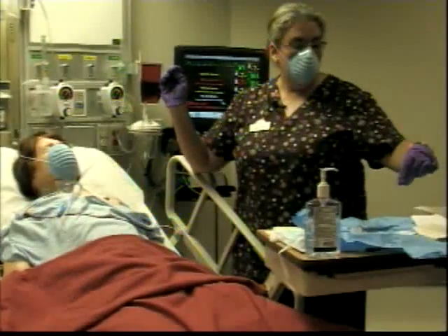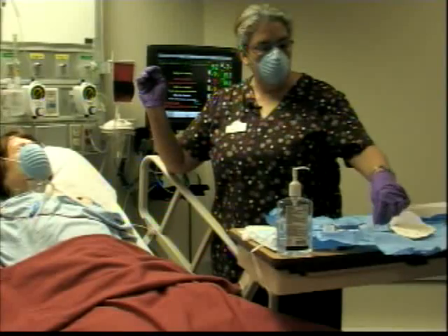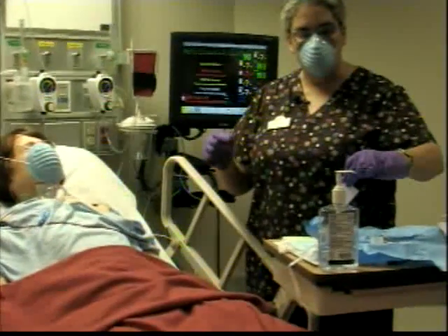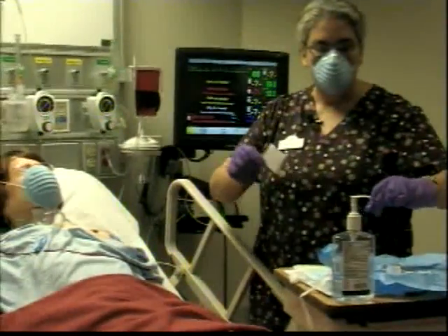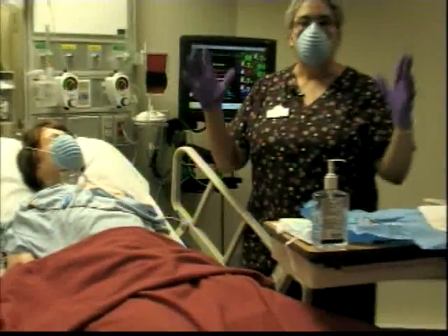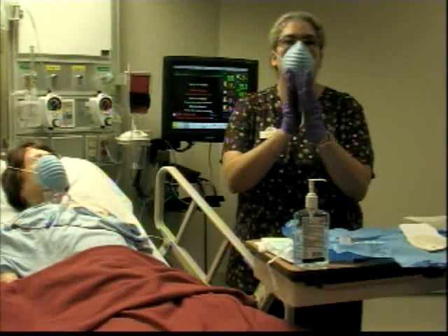Now we're going to use the split gauze. The same principle. Once you come across the field and you get into your 1-inch border, that part is contaminated, you grab it with your finger, stay hand here, coming back over there, put it on top. That stays right there. Once that is covering the site, you can put both of your hands together, because that is covered and you don't need to be sterile anymore.